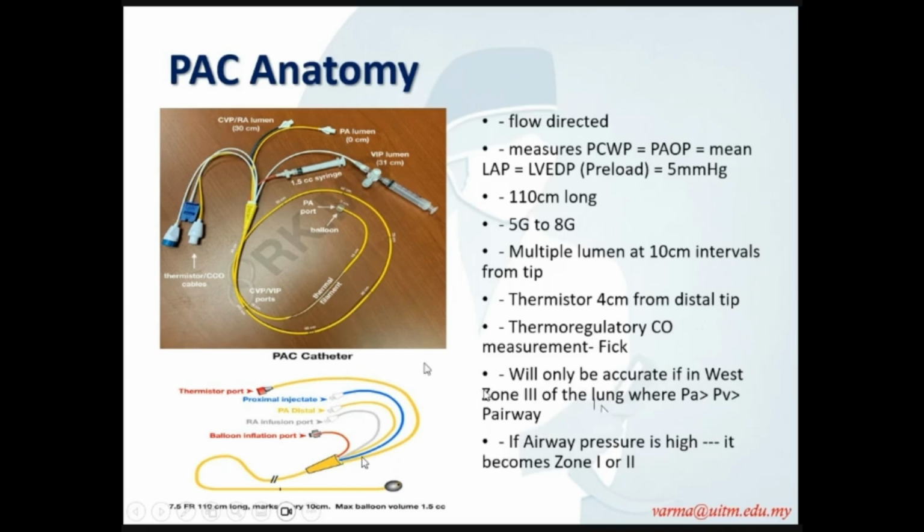So it has 4 to 5 lumens. One is a lumen for you to connect to your thermistor port. It detects your temperature change. Okay, this port.